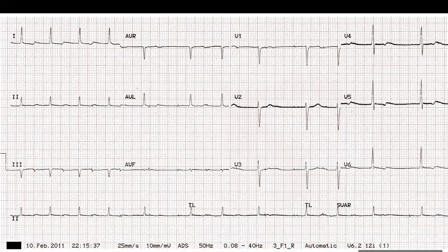On what basis? On the basis that there is a P wave, atrial pacing, followed by native conducted QRS. But we are talking about the atrium, and you are talking about the QRS. I want to assess the sensing of the atrial beat. Well, it is almost consistently pacing, so I can't comment on the sensing unless I have a native P wave. Exactly. So it's capturing well, but I can't assess the sensing.